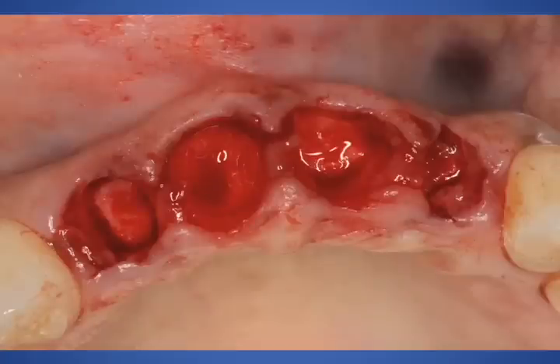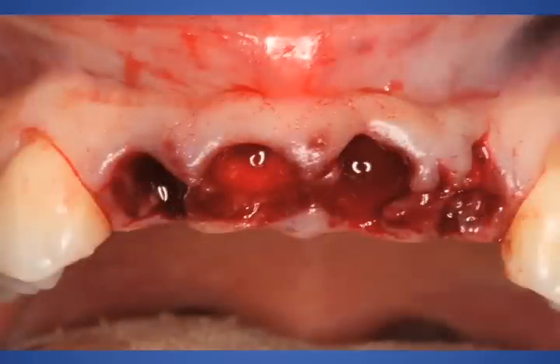And you can see after the extraction we have viable bone to work with, very shallow socket sites, so I feel very comfortable in the placement of our dental implants. We have pretty good width also because it's an immediate extraction situation. The buccal plate is really intact and should turn out to be a nice situation for us. Interdental papilla, trying to maintain those triangles as much as possible, is a critical part in the final aesthetics for this patient.